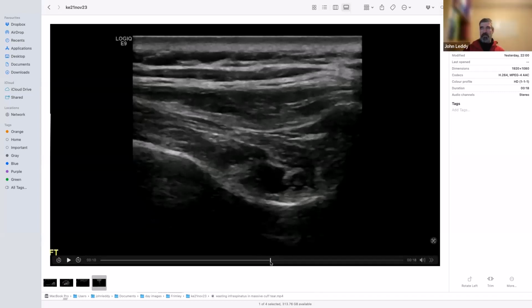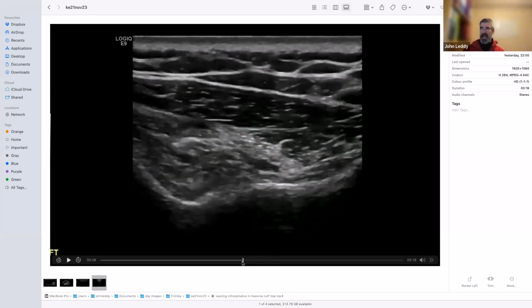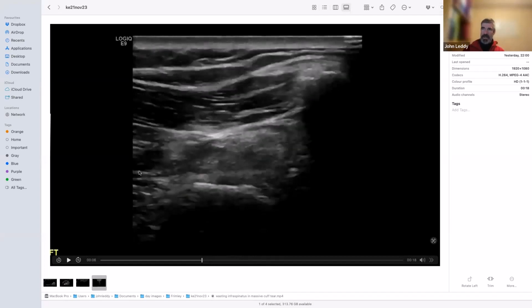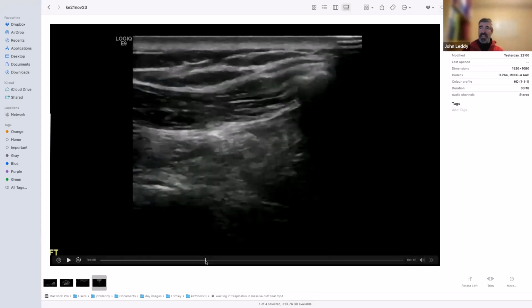Towards the back of infraspinatus, towards the spine, this is me coming in, not very elegantly, and this is just wasted here. So the wasting is actually in different parts, and you often see that. It'll be part of the muscle, maybe proximal or distal. Usually the more distal part is heavily wasted, and the proximal part is not. Whether that's because there's some variation in the innervation, I don't know.